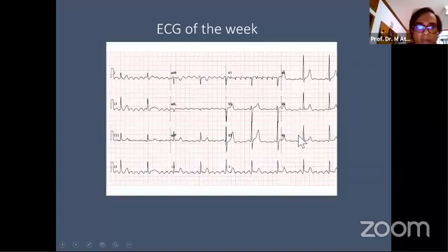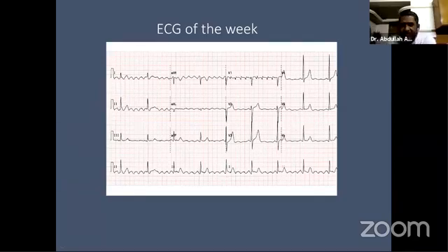This represents the left side of the body, and AVR, then lead 3, lead 2, AVF. This represents the right side of the body. Again, this is not our job, but if you see carefully, the left-sided leads show the sinus beat and the right-sided leads show the flutter-like wave. So this patient has got the tremor on the right hand. He had Parkinsonism and predominantly tremor of the right. So this is the reason.